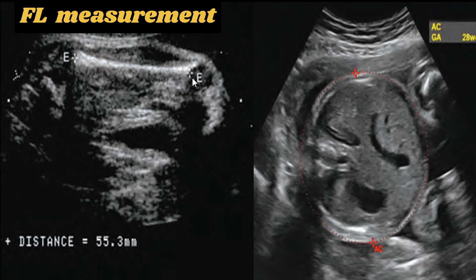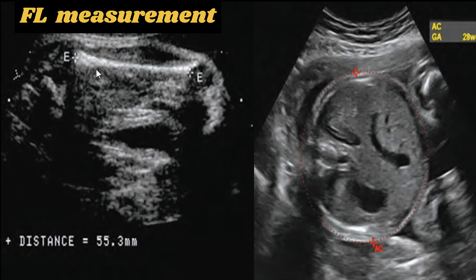Now we are going to discuss the measurement of femur length. The femur length is measured by positioning the calipers on the edges of the proximal and distal portions of the diaphysis. When possible, the femur should be placed perpendicular to the ultrasound beam. The epiphyseal cartilage, visible here, should not be included in the measurement.